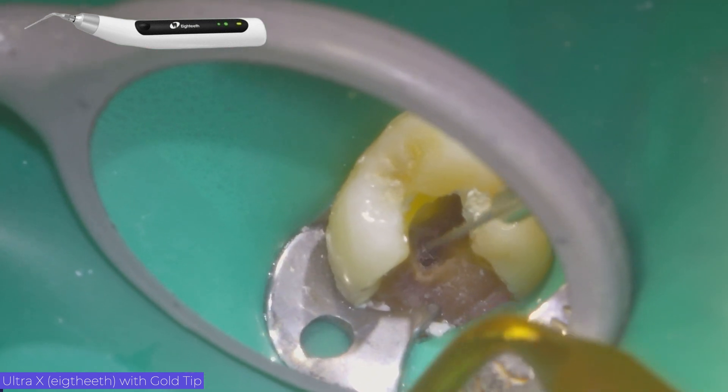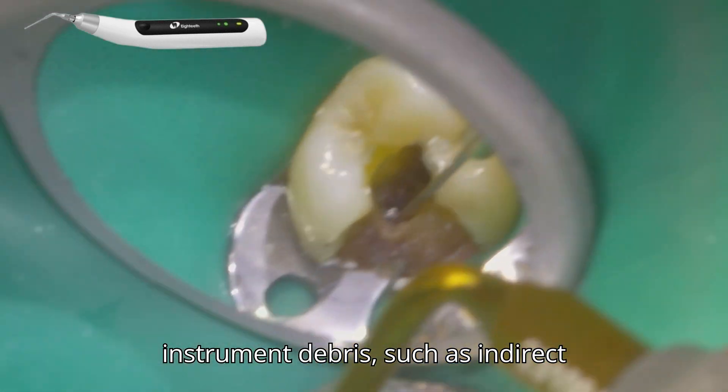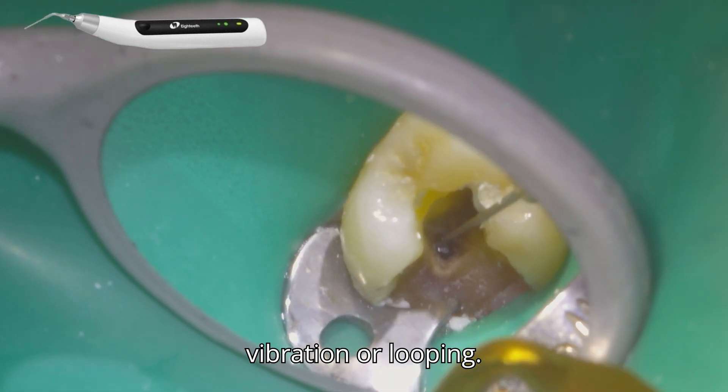Obviously, there are other ways to remove instrument debris, such as indirect vibration or looping.